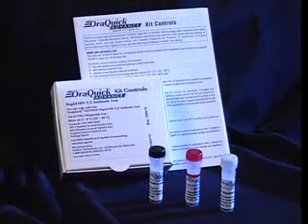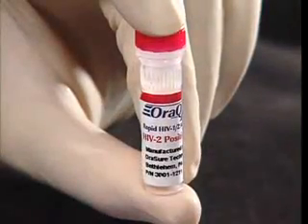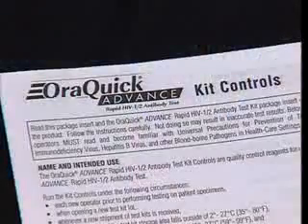Each test device has a porous flat pad, which is placed into the developer vial, and a test strip that can be seen through the result window. Kit controls for the AuraQuick Advance tests are also available separately. They consist of three vials: an HIV-1 positive control, an HIV-2 positive control, a negative control, and a product insert.